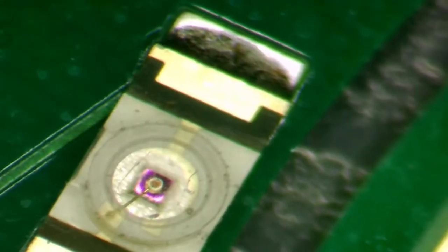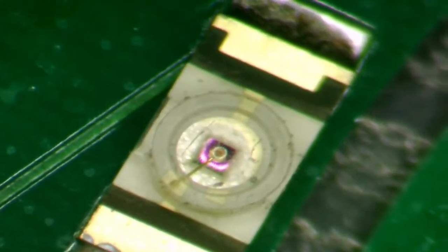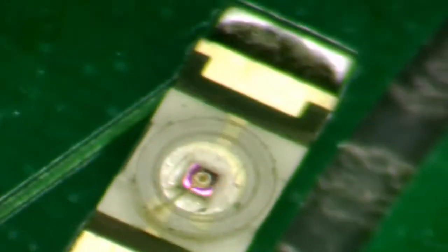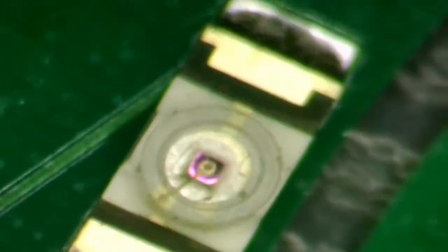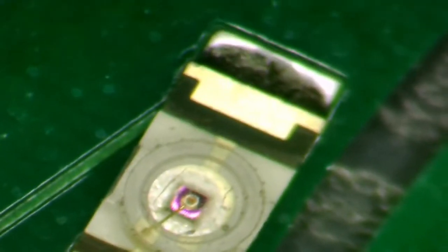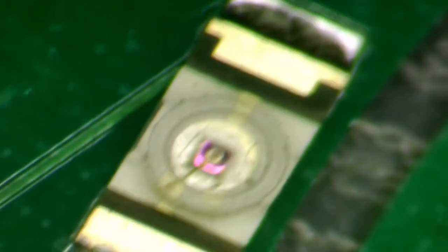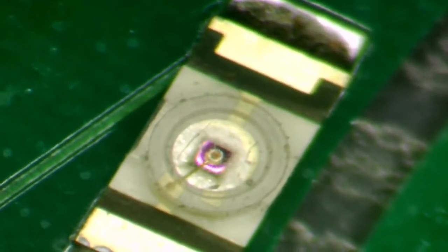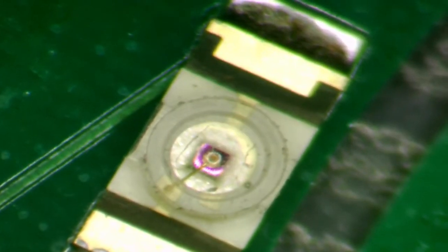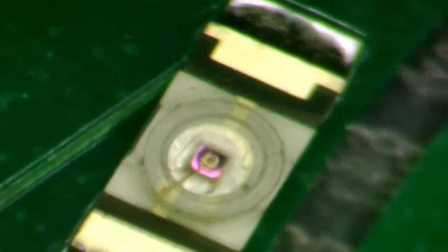So I've just zoomed into what I think are those LEDs surrounding the donut. The interesting thing is they have that purplish tinge, much like the center IC. Again, that might just be an interference pattern from something on the surface. Might also be a dye, and it's kind of small. I can't even get a great image from the microscope. Maybe there. So that's certainly one of those LEDs. And again, maybe the purpley color gives us some indication what color it actually is.